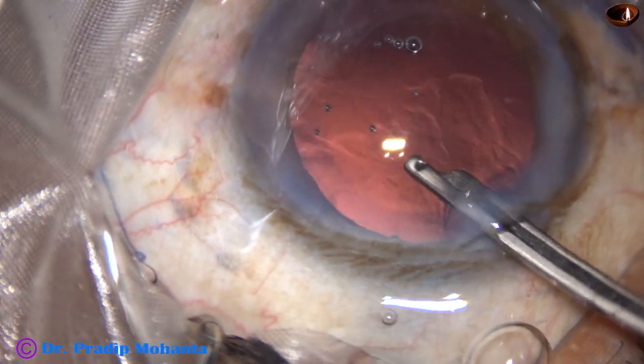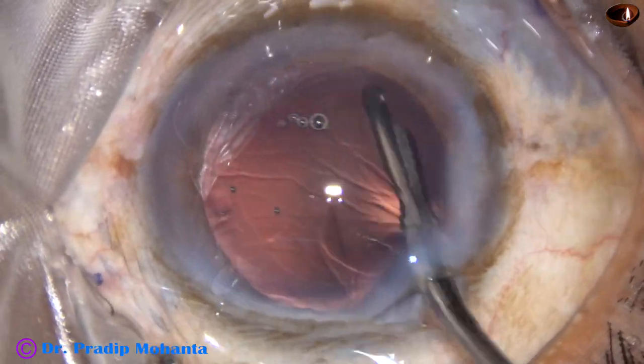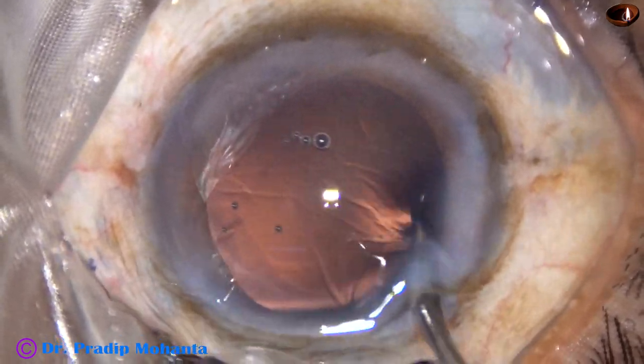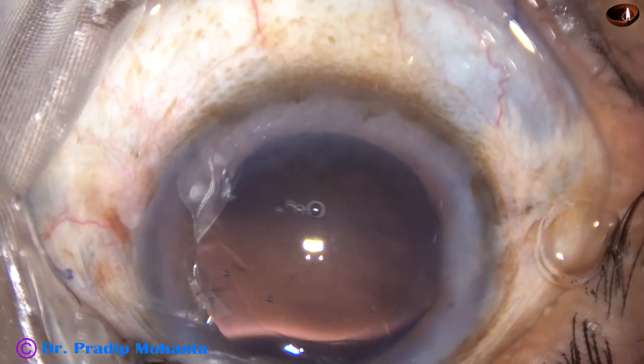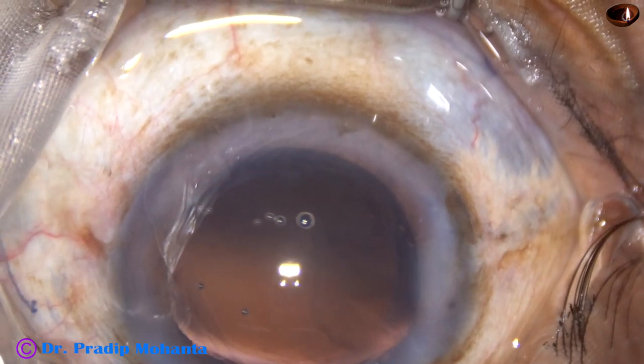In this case there is no sub-incisional cortex — only some cortex from 3 o'clock to 9 o'clock, which has been removed by the Simcoe cannula. Now viscoelastic is injected.